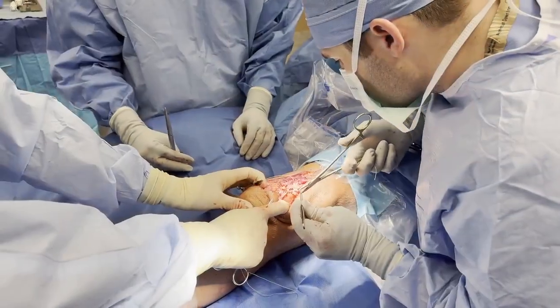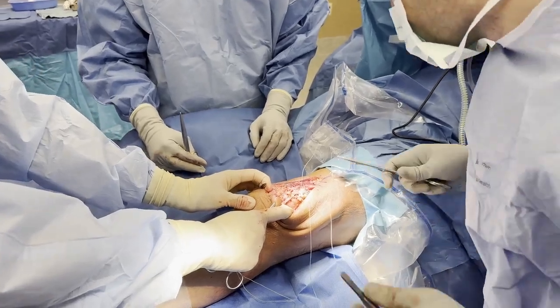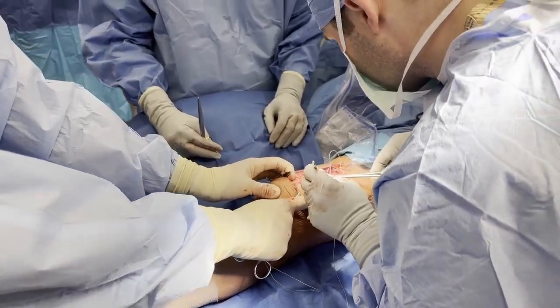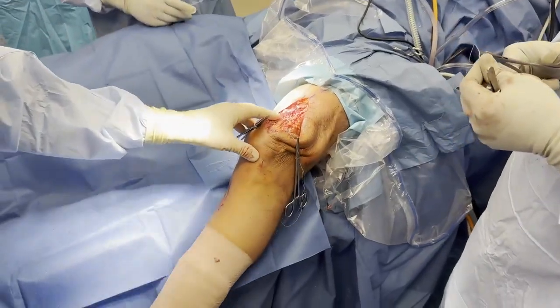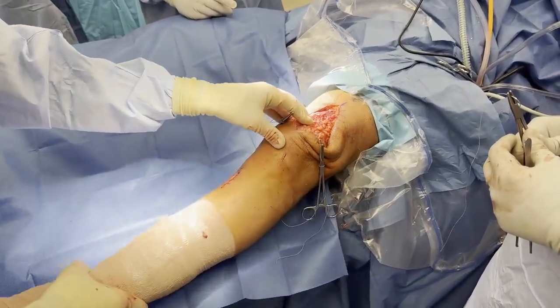The lateral and medial borders are then sutured side to side with number two non-absorbable sutures. The medial and lateral limbs of the autograft are then whip-stitched, starting proximally and working down the length of the quadriceps tendon for further support. The knee is then carried through range of motion to evaluate suture tightening and determine post-operative rehabilitation.